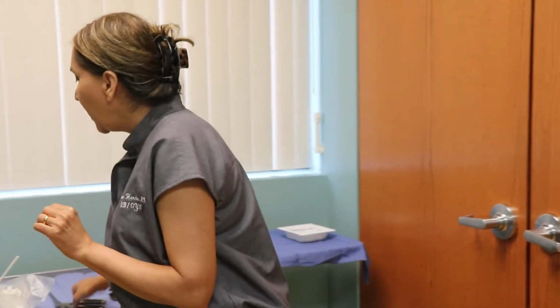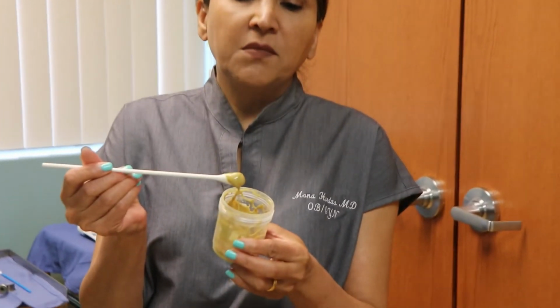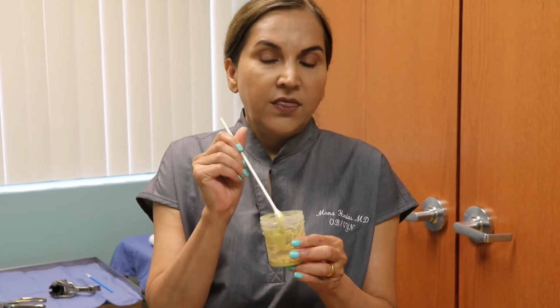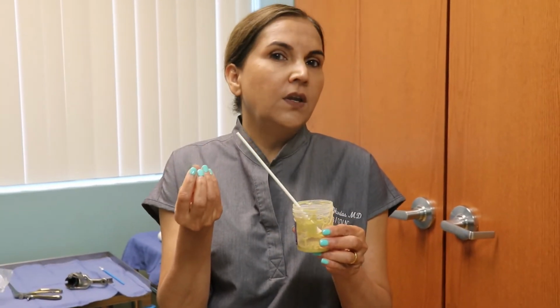So once the biopsy is done, you're going to have some bleeding, just a little bit of spotting and bleeding. So there's a medication we use called Monsel's. It kind of looks like mustard, doesn't it? Yeah. So we apply this on the cervix, and this is going to stop the bleeding. This will later come out as a dark brown, coffee-ground-like material. So if you see that, don't worry about it. It's because I use this Monsel's on it.